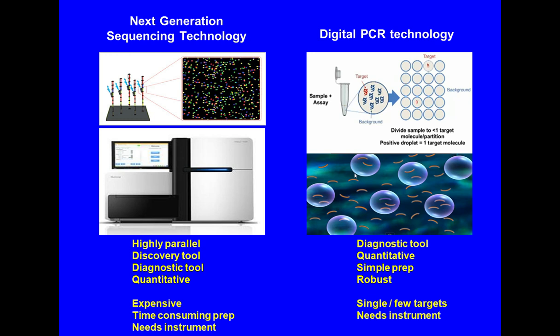So technologies that have been shown over the last 10 years to do a good job in characterizing circulating DNA and measuring the molecular profile of the tumor are NGS and digital PCR, among others. These are two established technologies, and I have listed the basic characteristics of each of them below.